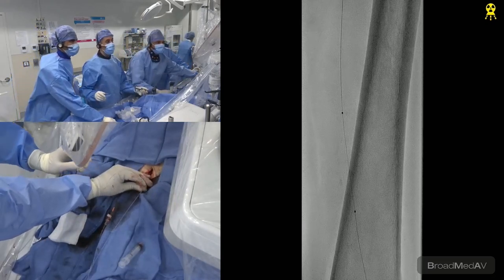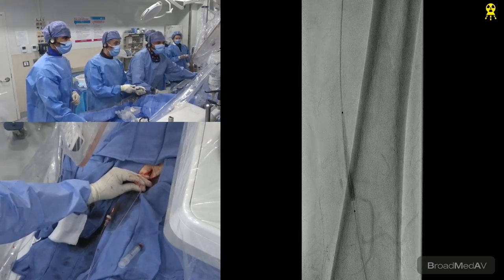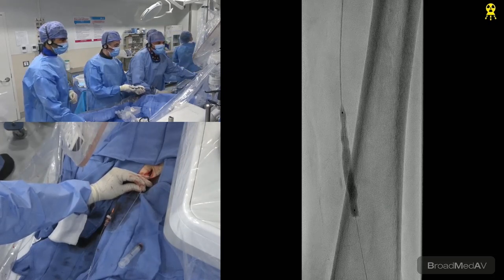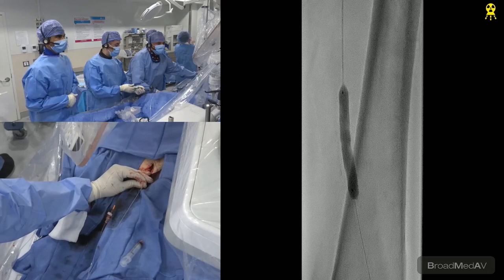That allows for the Supera to deploy nominally without really any real issues. No elongation, you go up, no shortening. And the result is always quite nice. But I think one of the keys to the delivery of this stent is vessel prep, without any question.